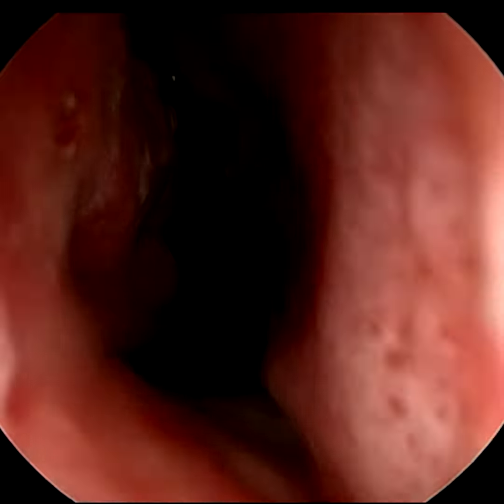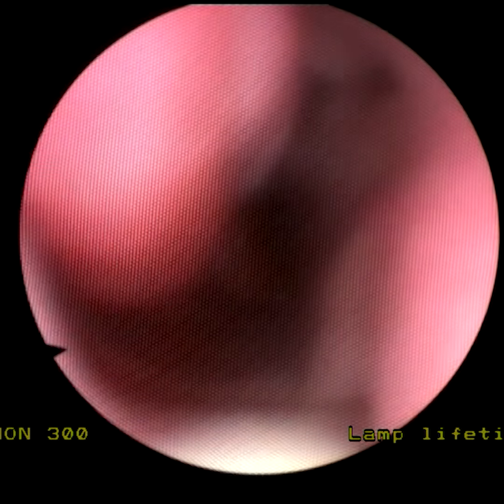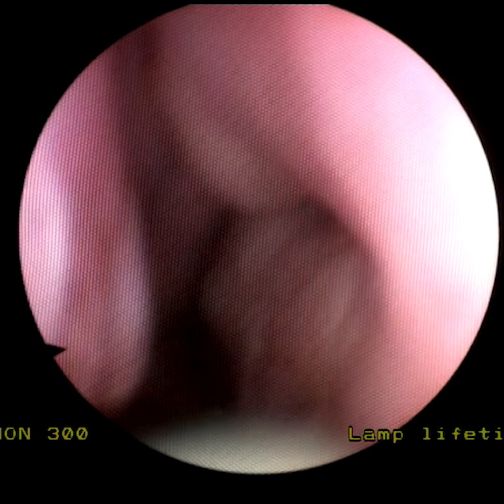Now this video is many months later and I'm sorry about the quality of the video here, but you can see that the turbinates have not grown back at all. Many of the other forms of turbinate operation result in a relapse and return of the blocked nose within a few months or so. You can see that this isn't the case with this technique.